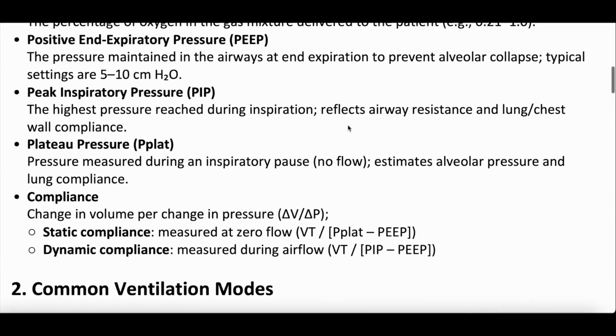Okay, PEEP, or positive end expiratory pressure. This is an important one, and it's a concept that is not that hard to master, but you do have to just think about it for a minute. So this is the pressure that is maintained in the airways at the end of expiration. The pressure maintained in the airways at the end of expiration.